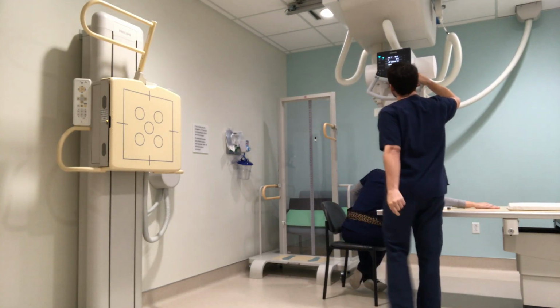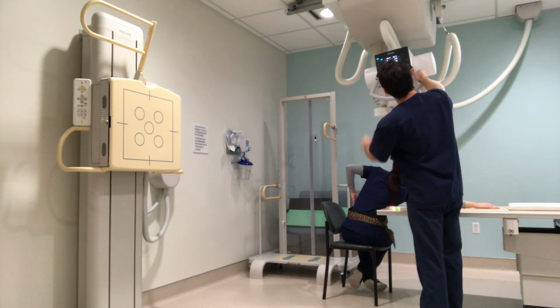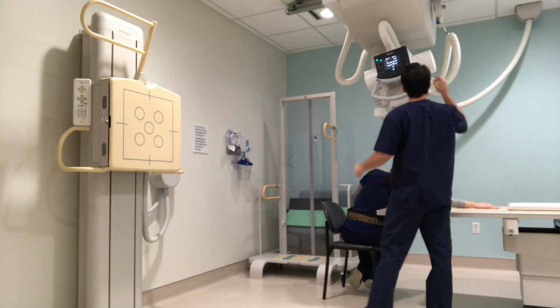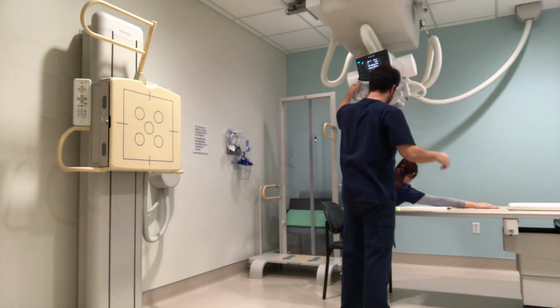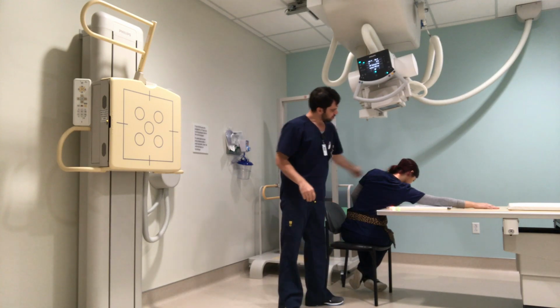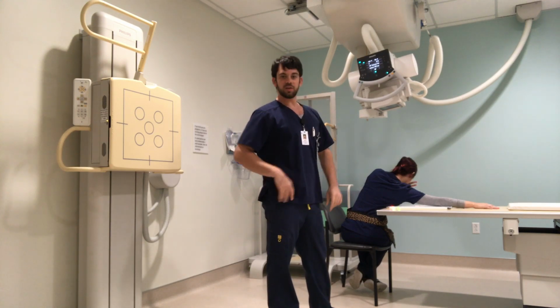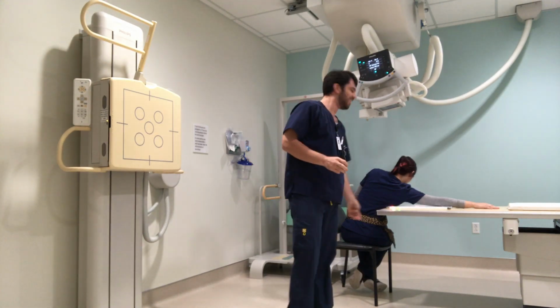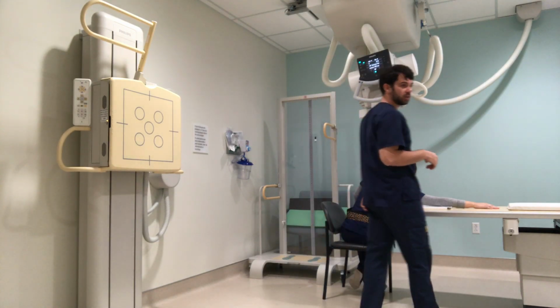I'm going to put an angle of, well, it's recommended 5 to 15, so somewhere around 10 is usually good. I'm at 9, so all right. Good. Lateral check from the hair. So this image is going to really give a good view of the humeroscapular joint, the scapulohumeral joint. And you're going to be able to see the acromion just superimposed right on the head of the humerus.